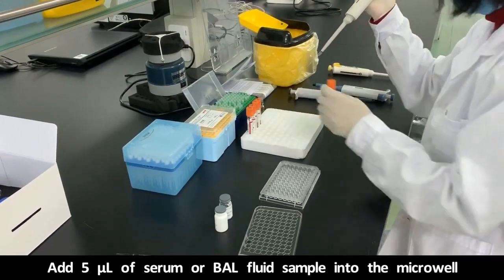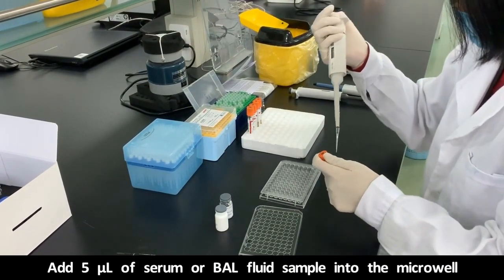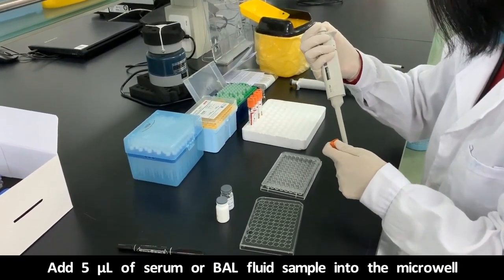And then 5 microliters of each sample is placed into the same wells.